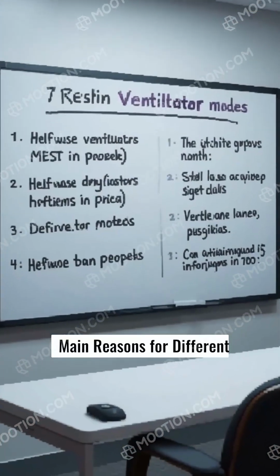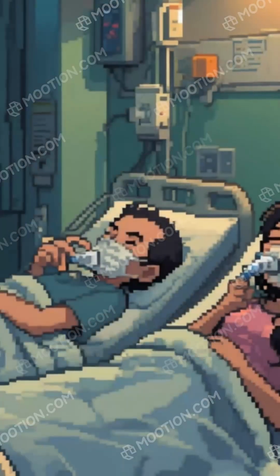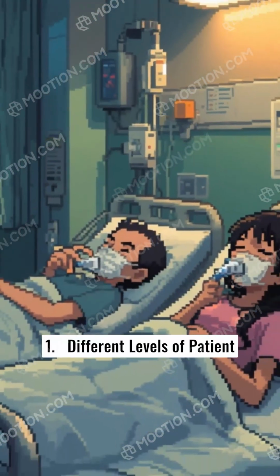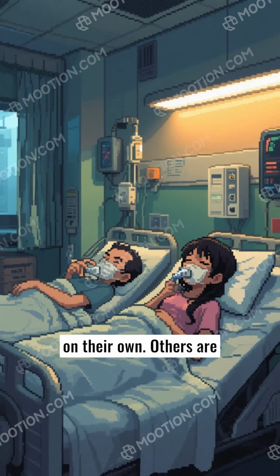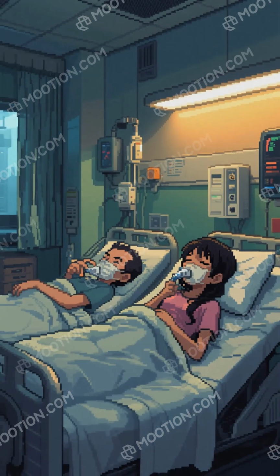Main reasons for different modes. 1. Different levels of patient awareness. Some patients are awake and can breathe a little on their own. Others are unconscious or very weak, needing full support.